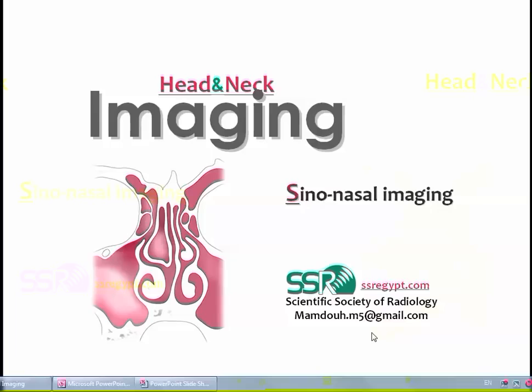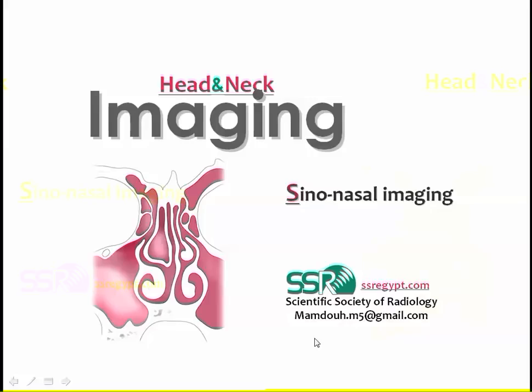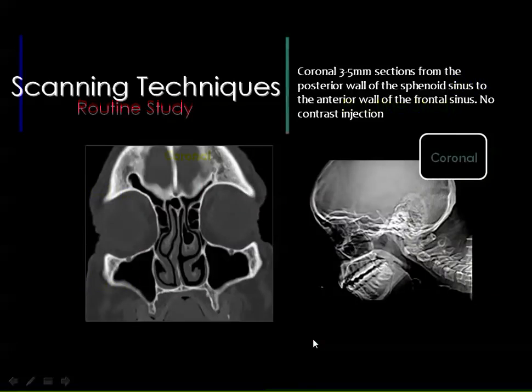Dear colleagues, this is the second lecture in the series of head and neck imaging. It will deal with the sinonasal imaging. We will start by the anatomy and the scanning techniques.